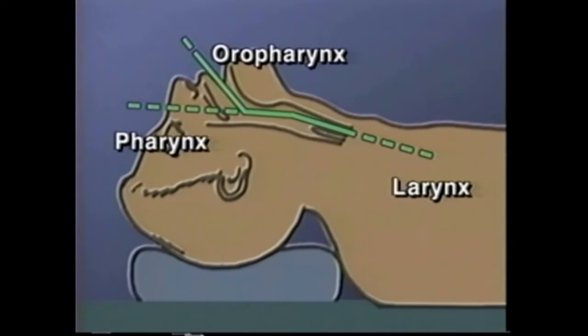This positioning is contraindicated in known or suspected cervical spine injury. Head elevation is also not recommended for children and infants because of their relatively large head size and more anterior location of the pediatric larynx.